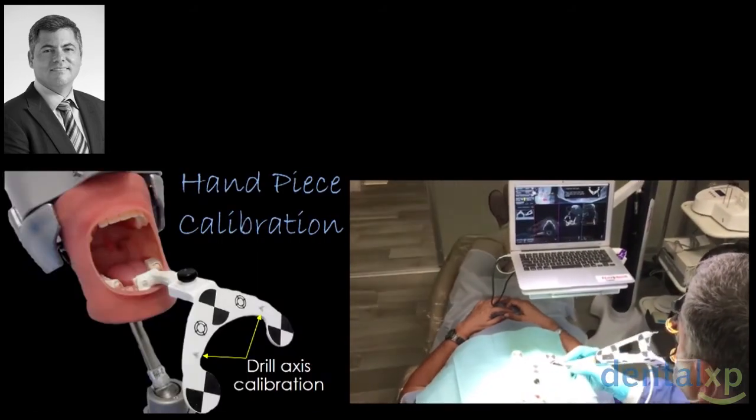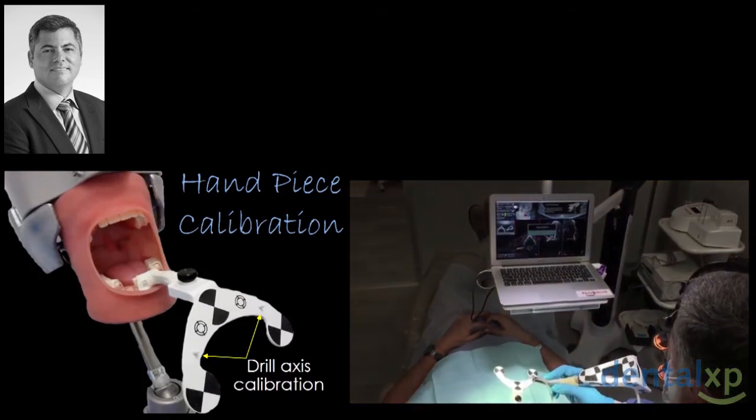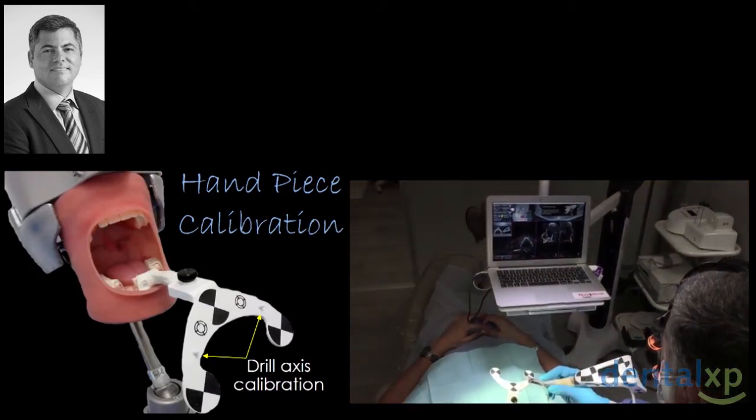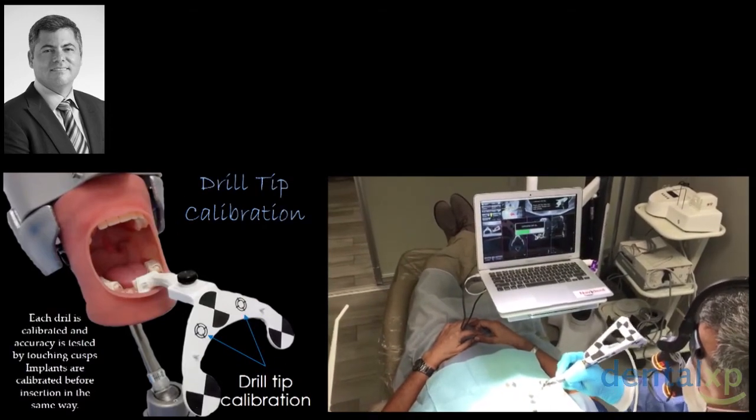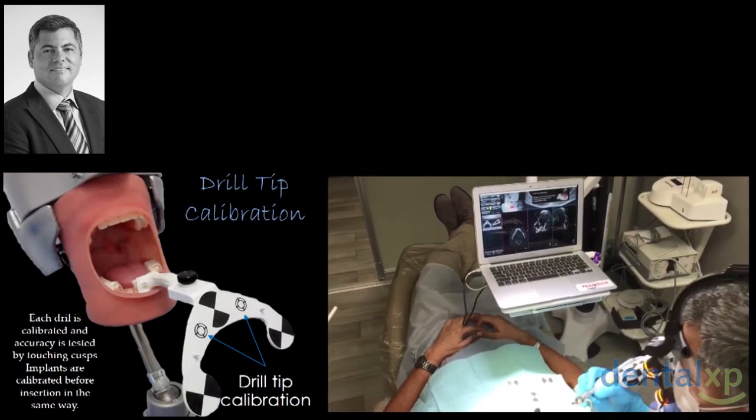The navigation process starts with the calibration of the drill axis, which is putting your handpiece into this little tip over here and rotating. It happens very fast. The software has been improved dramatically in the last several months. And then you go into the drill tip calibration by placing the tip at this area where there is a little dimple.